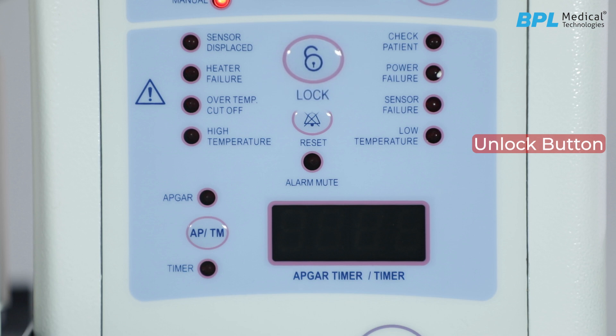Unlock button: the warmer will be in lock mode by default. Long press the unlock switch to unlock the warmer. It automatically changes back to lock mode after 30 seconds.